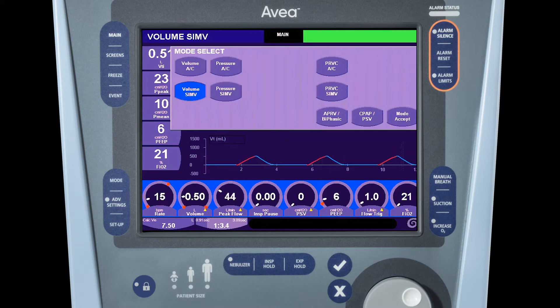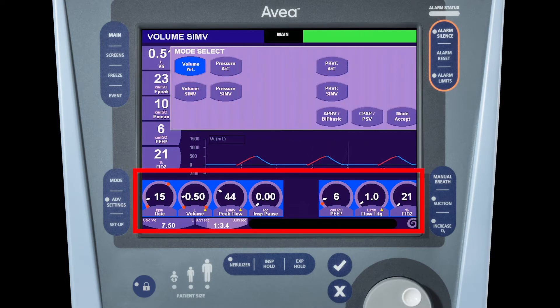If you wish to change a mode, simply select the mode — in this case, volume assist control. When you do that, you will see that all the controls are highlighted with a bright blue background. This indicates a block change, meaning that you can change all of the controls simultaneously when accepting the mode.